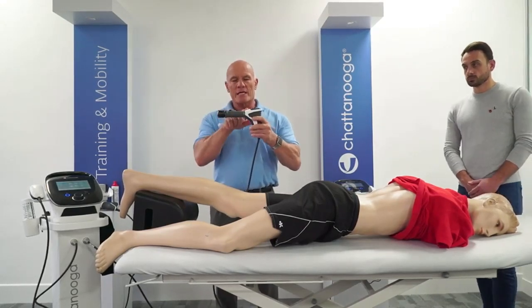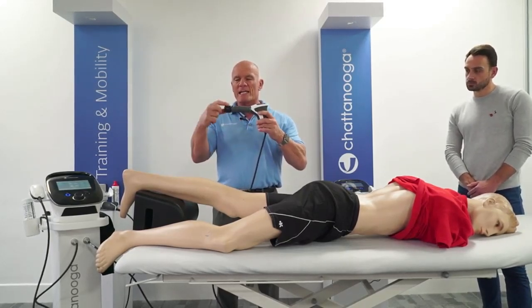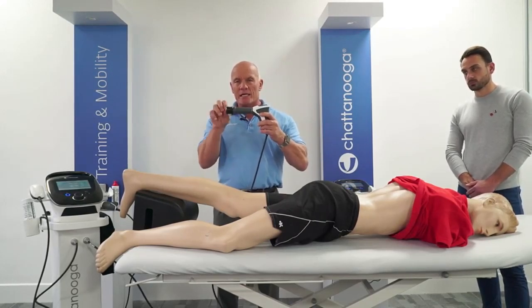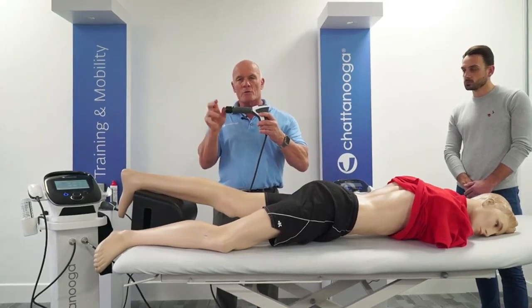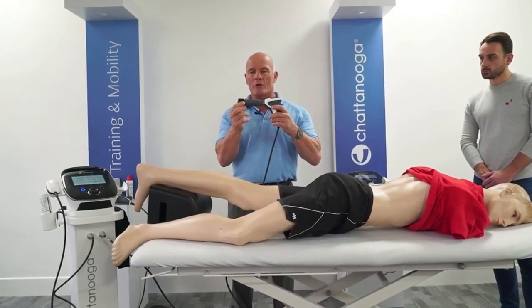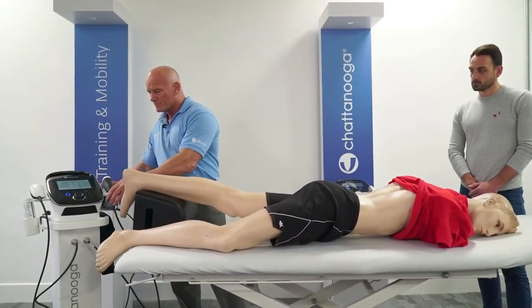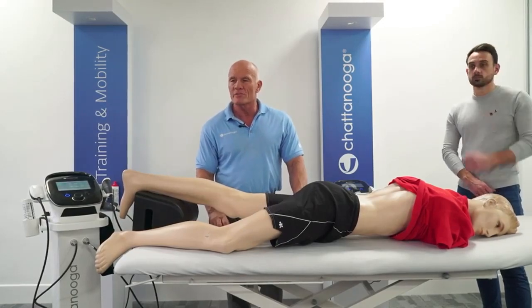Okay, so in here you have a projectile. It comes along, it hits this transmitter, which converts that kinetic energy into acoustic pressure waves. It's those acoustic pressure waves which have the therapeutic value on our patients. Okay, moving on.